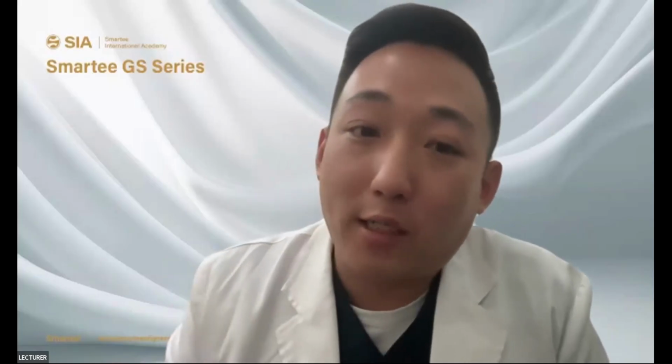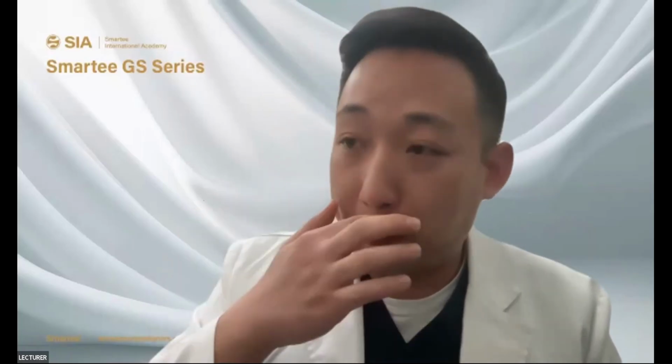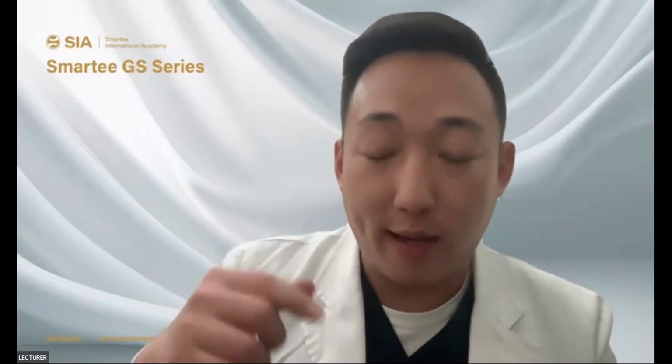For what age? Actually, for us, more than 80% of the patients are adults. The oldest patient for us is 69 years old. Actually, the condyle has the ability of adaptive remodeling during the whole life.